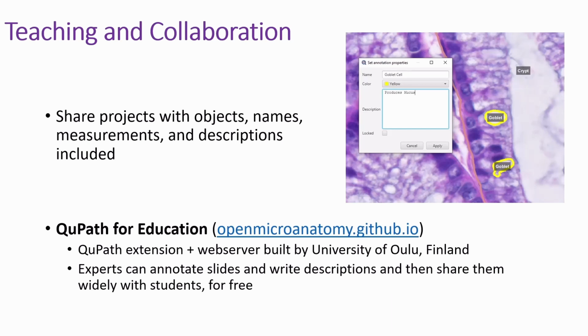And if teaching histology or microanatomy is something you do, or something you'd be interested in trying to do, I highly recommend looking at this extension. There's a demo online that you can play with, and you can see how powerful the tool is. The only problem is the demo is written in Finnish, which I don't speak, but it's a great example of how you can actually do this teaching in whatever language you're most comfortable with.